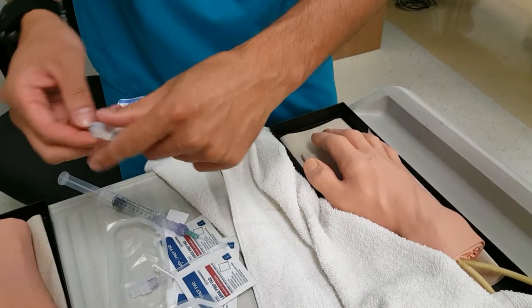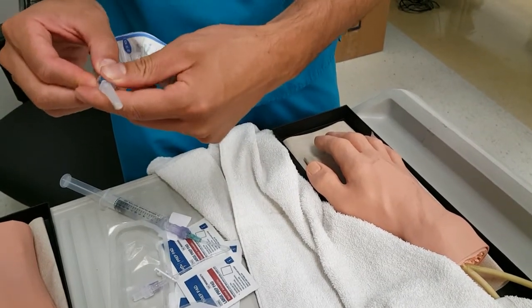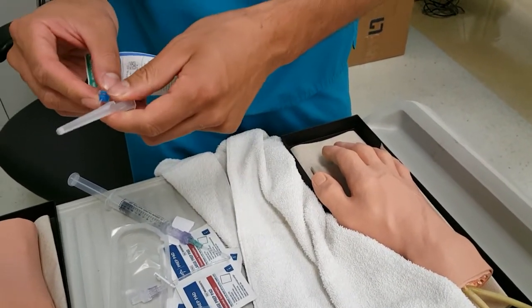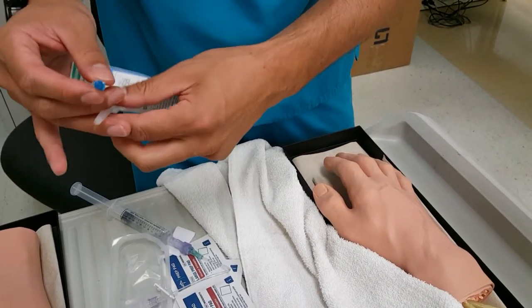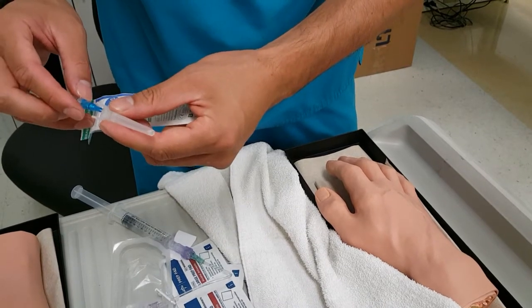This one I'm using a 22 gauger — you can tell by it being blue. I kind of loosen this up too, to make it easier when I'm doing my insertion, and then I put it back.